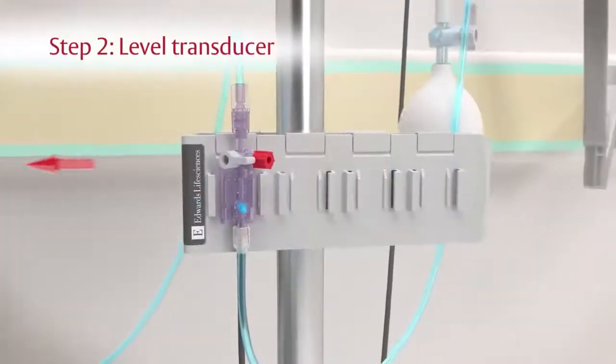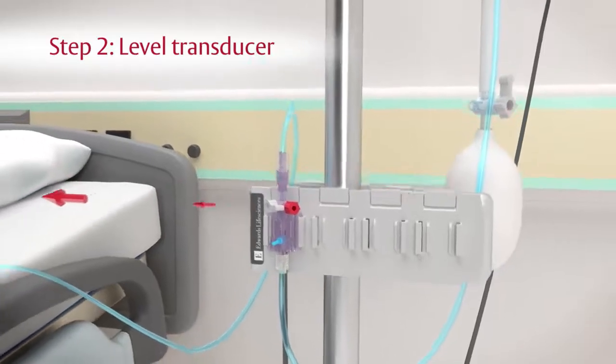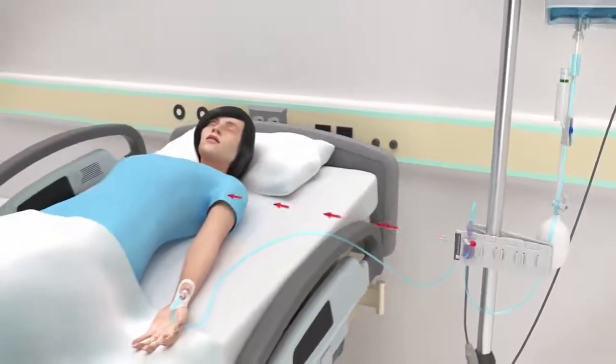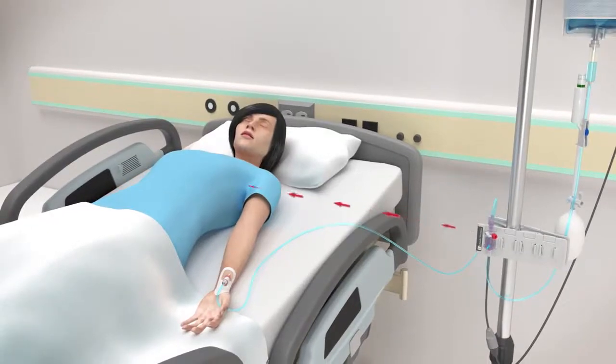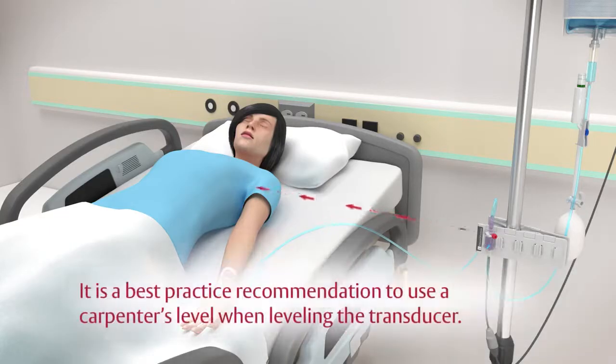Step 2. For intravascular pressure monitoring, level the transducer to the patient's phlebostatic axis, which can be found at the midpoint between the anterior and posterior chest wall at the fourth intercostal space. It's important to maintain the level of the transducer with the phlebostatic axis at all times while monitoring to ensure accurate pressure readings. It is a best practice recommendation to use a carpenter's level when leveling the transducer.